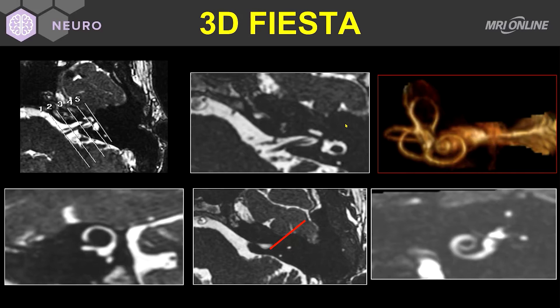As with CT, these Fiesta, CIS, and Turbo Field Echo scans can be reconstructed in multi-planar view. This is an example of using 3D Fiesta to look for superior semicircular canal dehiscence. We've taken the axial anatomy in the Fiesta sequence and reconstructed it in an oblique fashion to look at the semicircular canals. Here we have a reconstruction through the superior semicircular canal coming to the vestibule, and we note that there is bone above the superior semicircular canal between it and the brain — therefore, there is no superior semicircular canal dehiscence in this example.